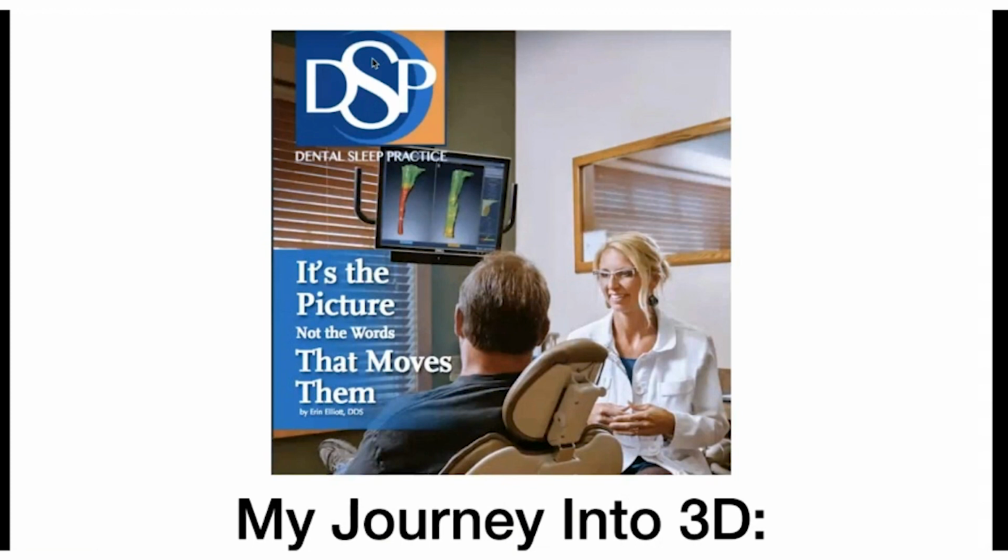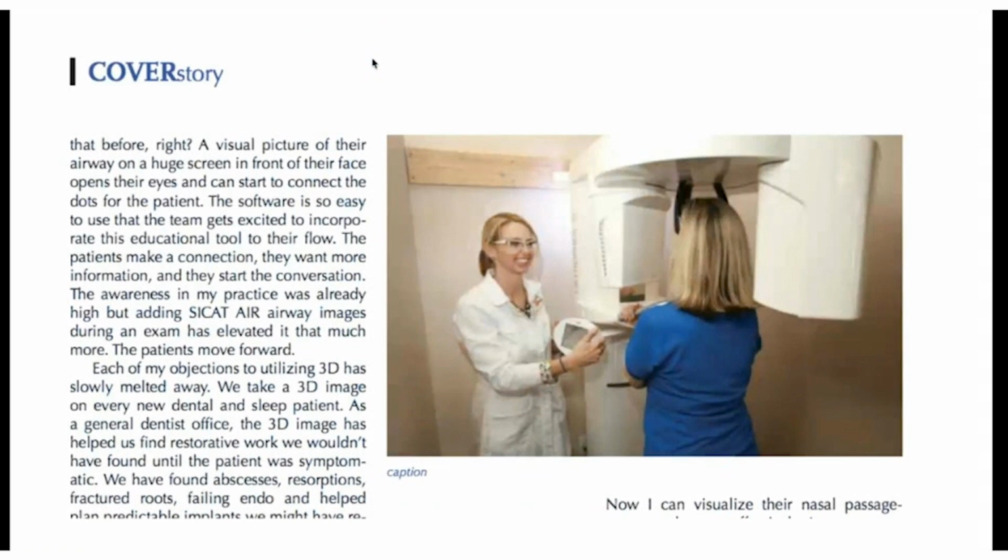Well, what I didn't realize once I had cone beam is how much it benefits my sleep patients. A lot of it is the conversation starter, connecting the dots, why dentists care about sleep and how we're so close to the airway. But a lot of it is so that I can see their nasal obstructions, we can see their sinuses and turbinates, and I'll share some of those findings and how it makes an impact in sleep.